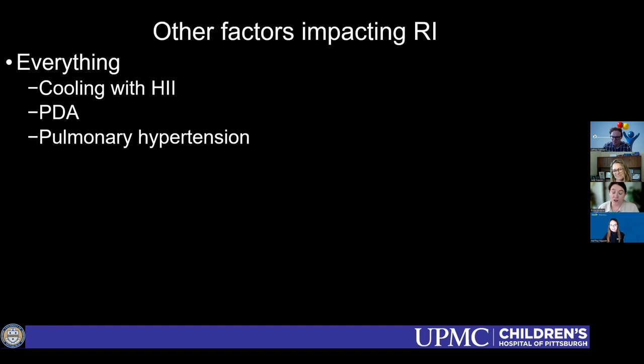It's actually our neurosurgeons there became true believers as well. So the idea behind the compression is that you, with your transducer on the anterior fontanelle, while you're doing your ACA Doppler, you do gentle downward compression on the anterior fontanelle. And then you always do it in real time, and you will watch the resistive index change in relationship to the pressure that you're putting on the anterior fontanelle and the minute changes of intracranial pressure.